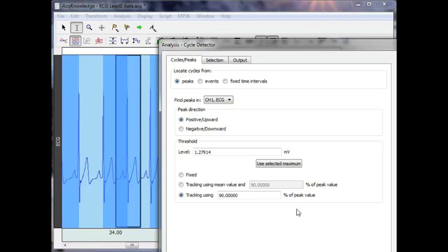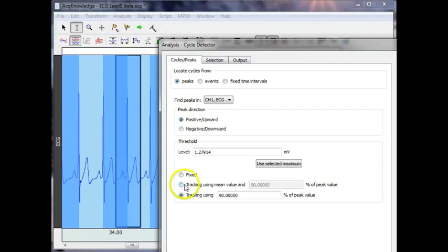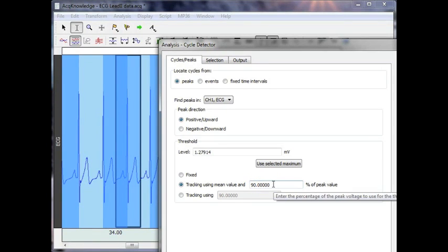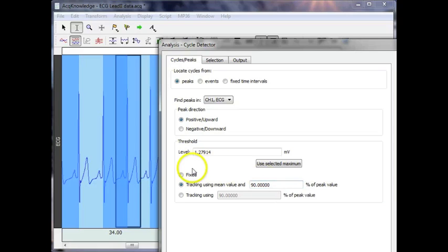There's also a mode whereby the system will locate the peak, look at the mean value, and set the threshold as a percentage of that mean value.